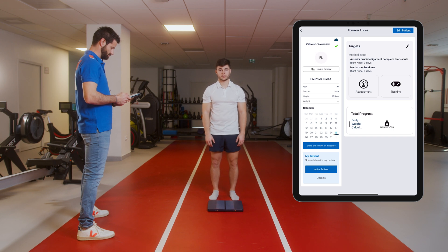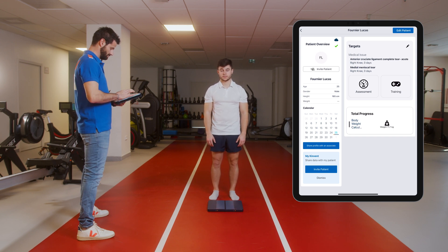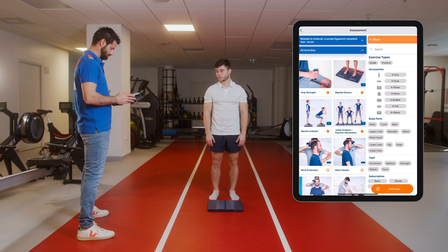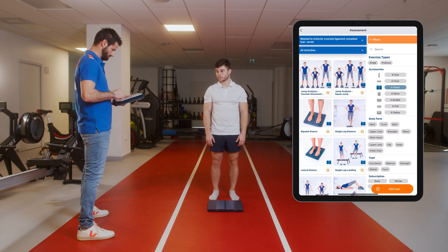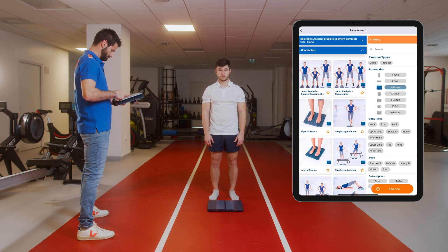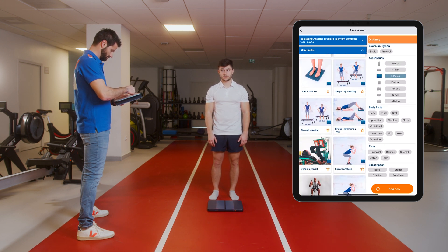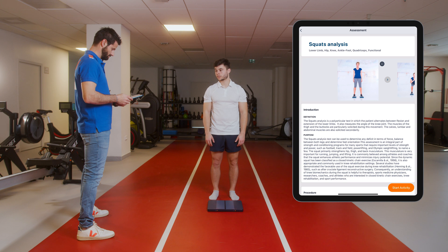In this tutorial, we will assess the squat capacities of your patient in order to draw your attention to a potential loss of balance in the distribution of his body weight and in the strength of his lower limbs.